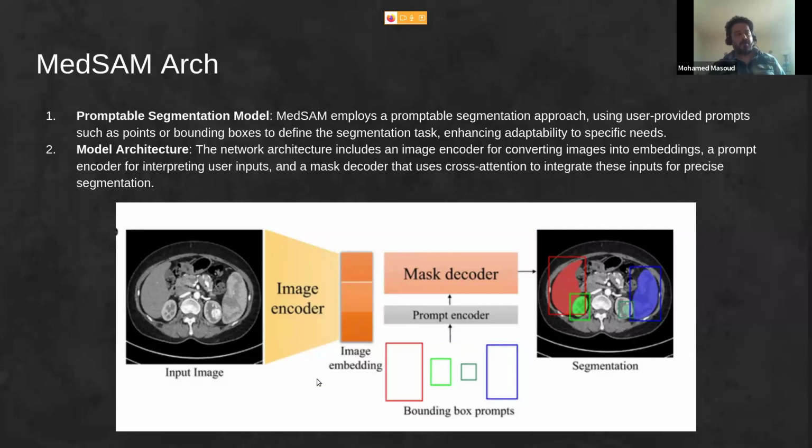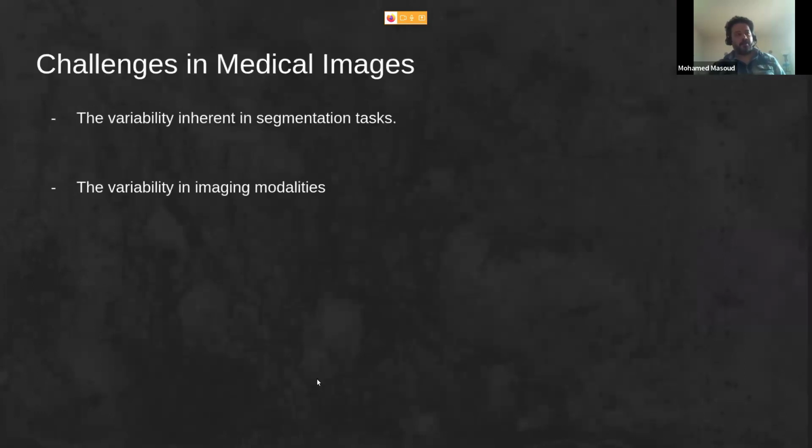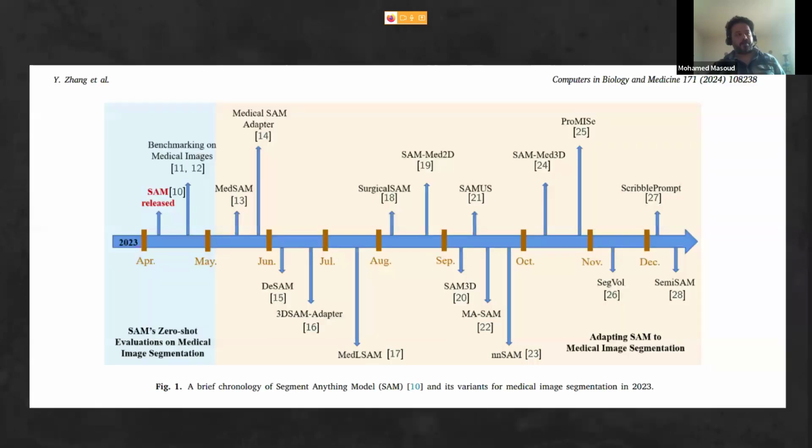And if we go here to the survey paper, some models come later, like SAM-Med3D or SegVol. I guess these deal directly with volumetric data, and they change the internal architecture of all these parts. Instead of any 2-dimensional component, they add 3-dimensional ones, like 3D convolution.